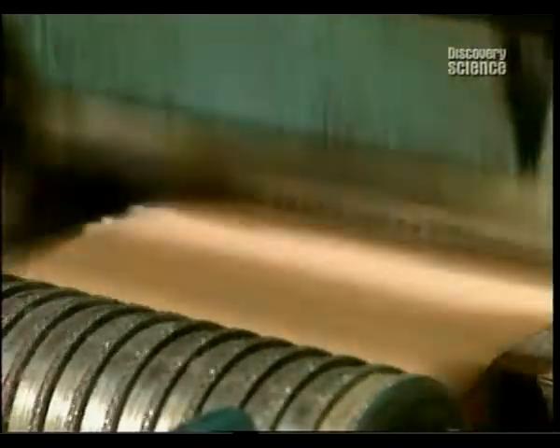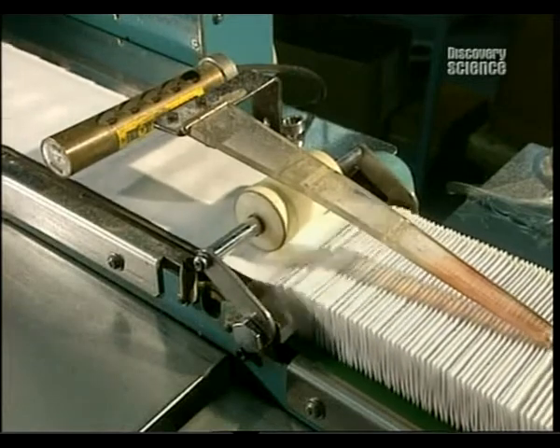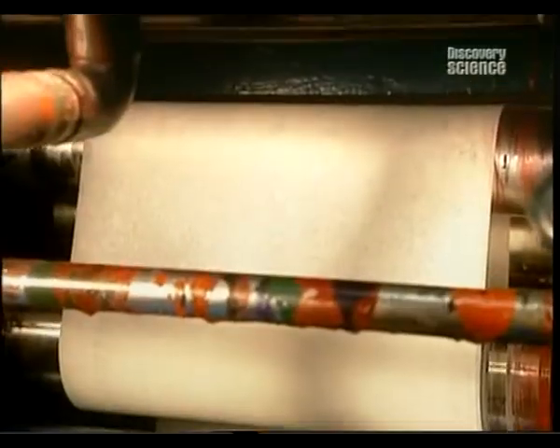Certain types of plaster have to go through a sequential bandage machine to have aeration holes pierced in them. These holes allow air to circulate and help promote healing. The plasters are now ready.